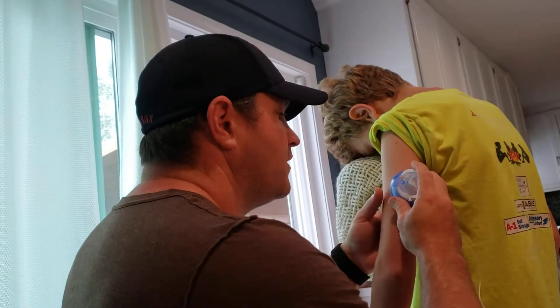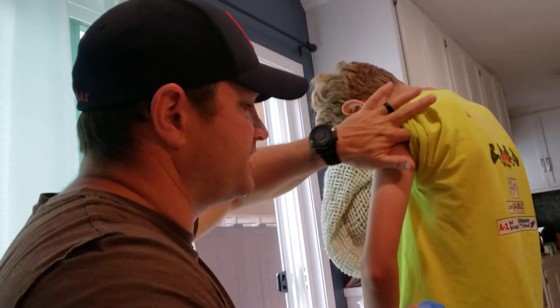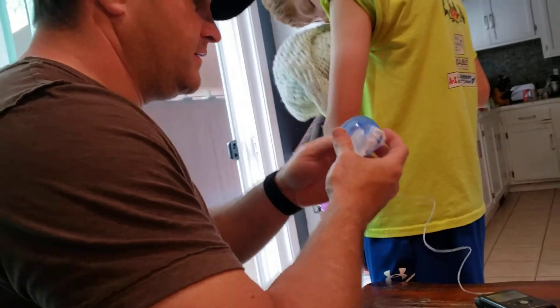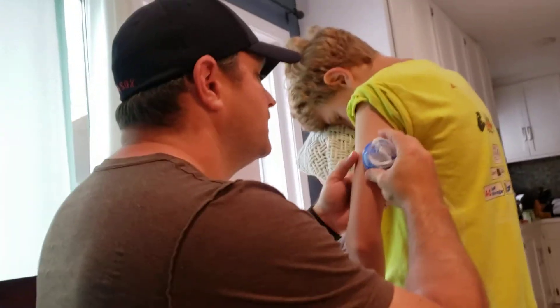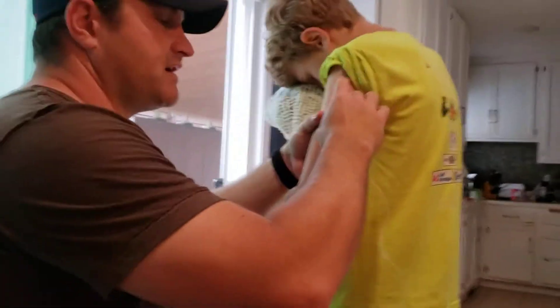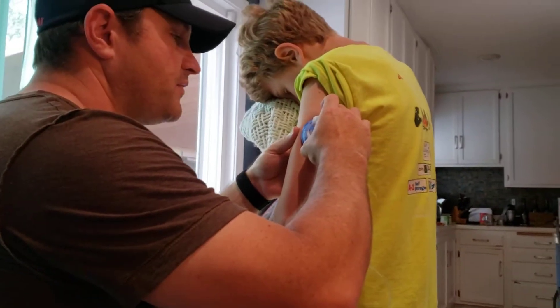Right here is Aiden's arm. We put it cord up so it can go up through his t-shirt and down into his belt. I put both thumbs on the side of the injector and then I count to three with Aiden: one, two, three — boom.